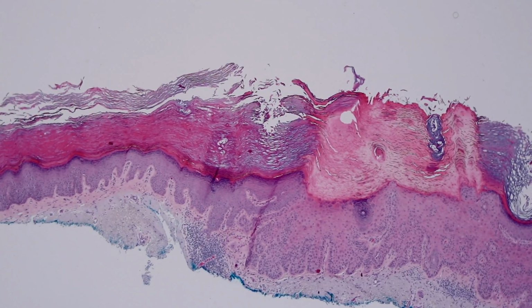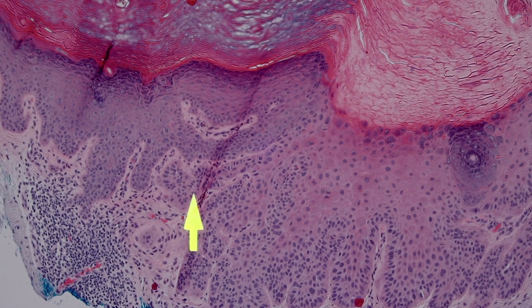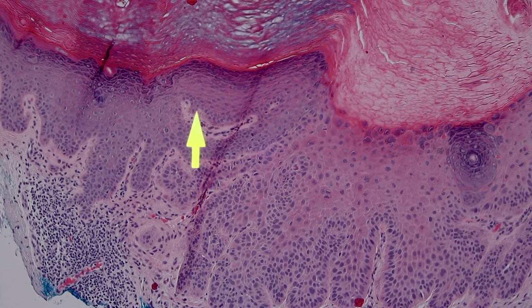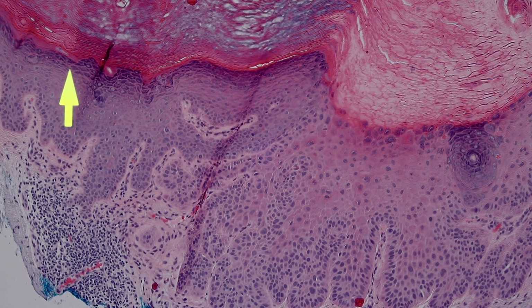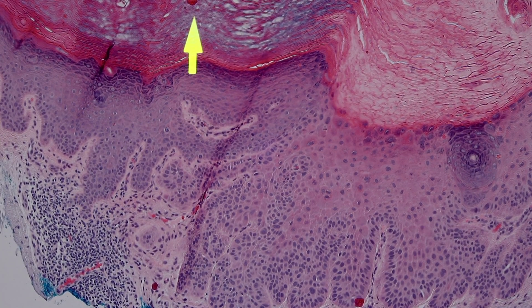And then here's a good example of comparing and contrasting the actinic keratosis here on the right with the relatively normal epidermis on the left. Although you can see the granular layer is quite thickened here, and that's because this has been scratched and rubbed. So this is a little bit of lichenification, or lichen simplex chronicus change, which is the chronic reactive change that the skin gets from repeated scratching and rubbing.